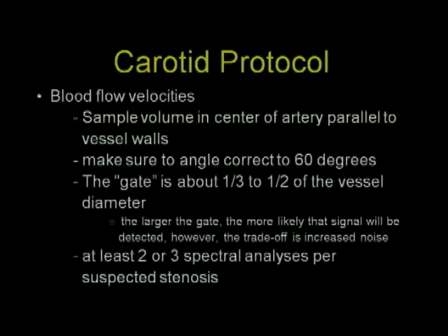The acquisition of blood flow velocities, of course, is paramount. By convention, we place the sample volume within the center of the artery with the angled cursor parallel to the walls of the vessel. We insist, at least at Montefiore, that the technologist, sonographer, angle correct to 60 degrees.